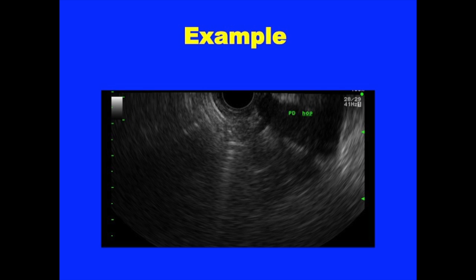In this slide, which is a little bit dark here for you, this is the muscularis propria of the duodenum. This is almost not recognizable to you because it's such a dilated main pancreatic duct. And what is very nicely demonstrated is that this runs completely through the wall, through the ampulla.